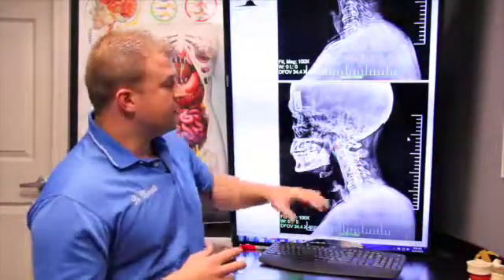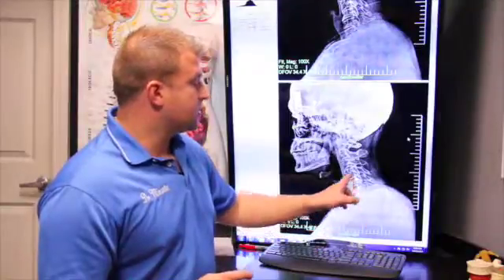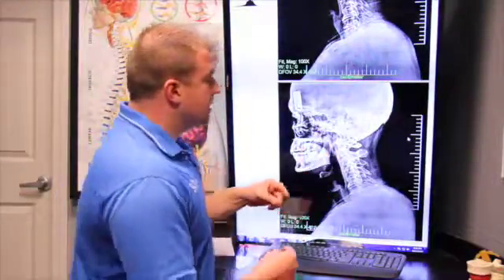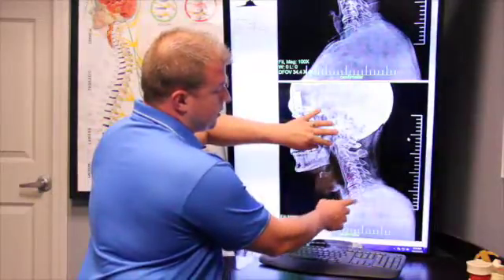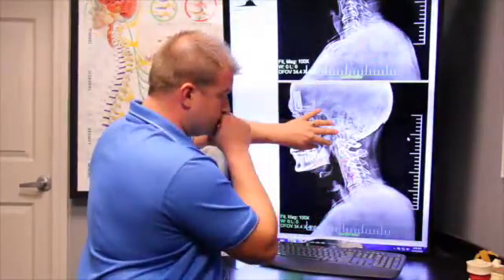And so when we look at the motion x-ray, in the case of this gentleman right here, you can see he's completely lost any integrity of the proper curve he's supposed to have in his neck. His neck is actually straightened out, so the head travels forward. To understand how this gentleman's spine moves, we can take a nice transparency and place it over each one of his bones right here. So we see a box drawn around each and every one of the bones.